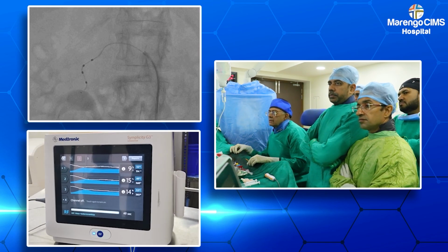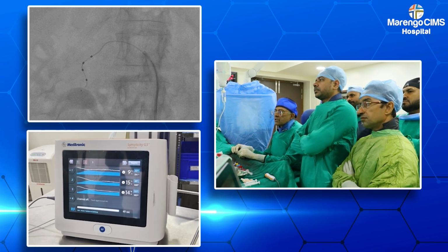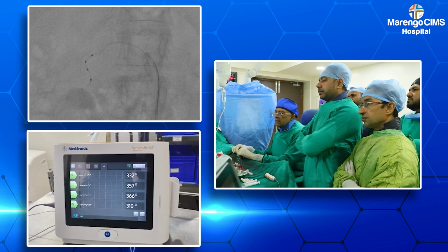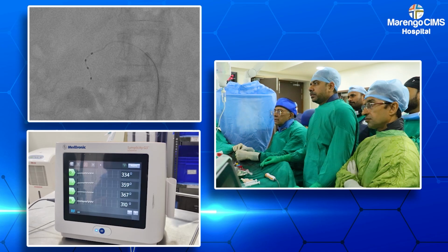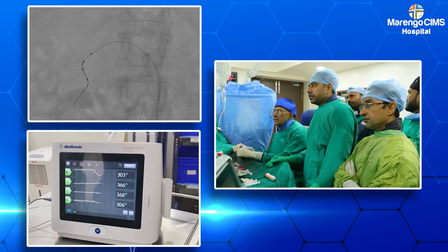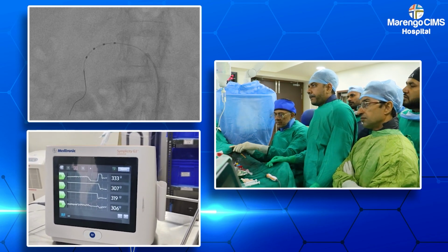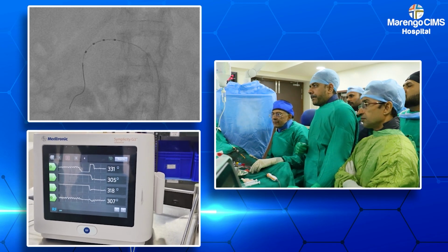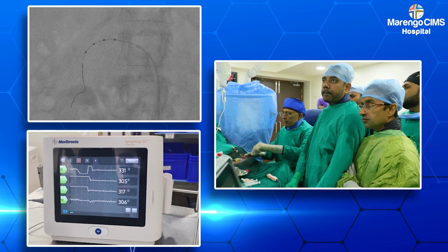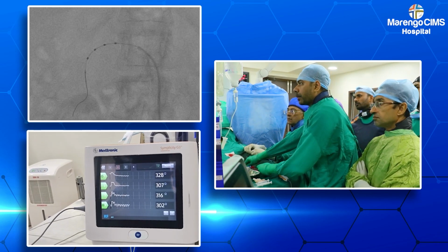So we have ablated this inferior branch except for the proximal segment where there was concertina effect and or some spasm. So we may pull back, introducing the wire. Again, pulling and pushing should always be with the wire support. So now we'll pull back and we'll keep one electrode here, pull back the wire again, see if we can properly place that one electrode only into the proximal segment of the inferior branch and make sure there is no overlapping effect also.